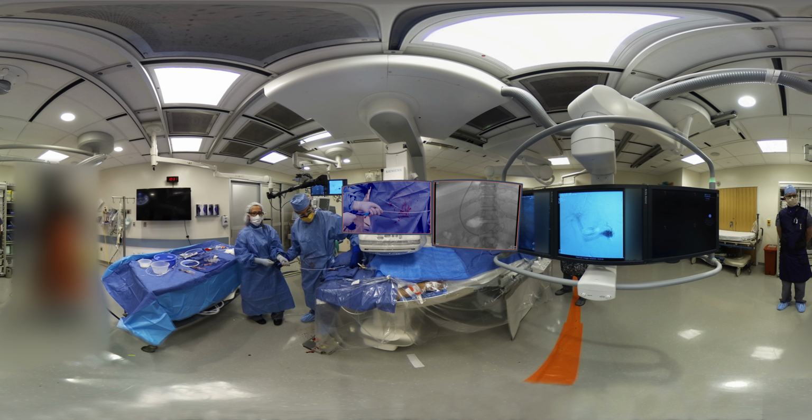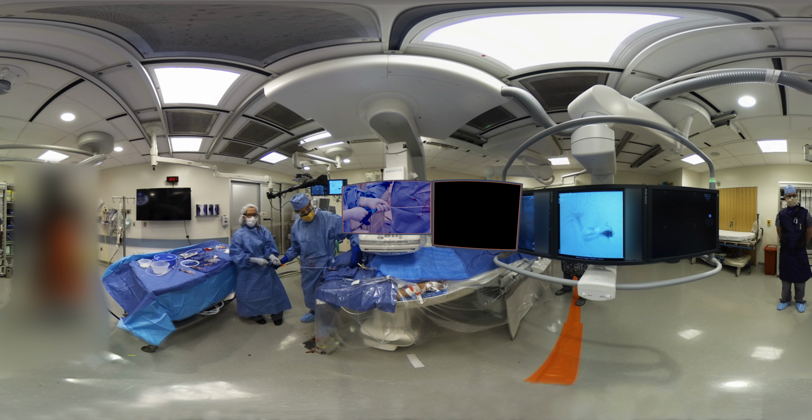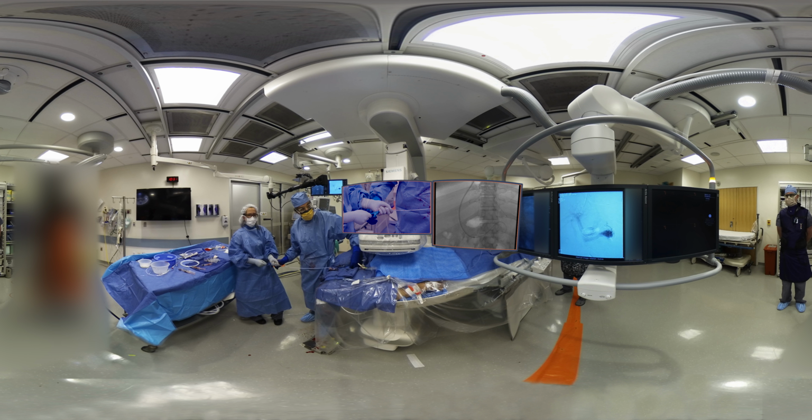There's no reason to continuously use fluoroscopy. Notice that we're using the least magnification for as much as possible to keep our doses down, both for us, for personnel, and for our patient.